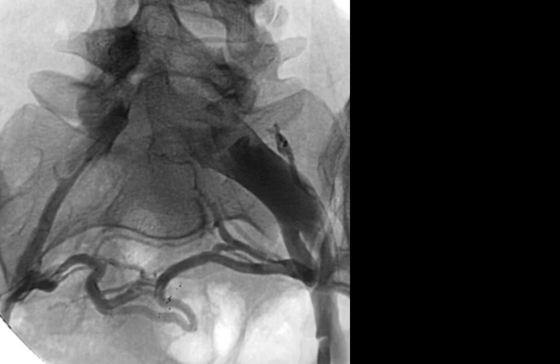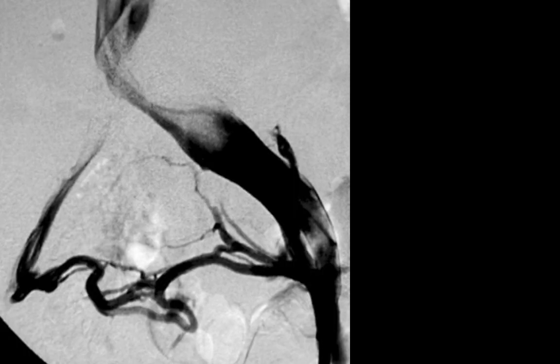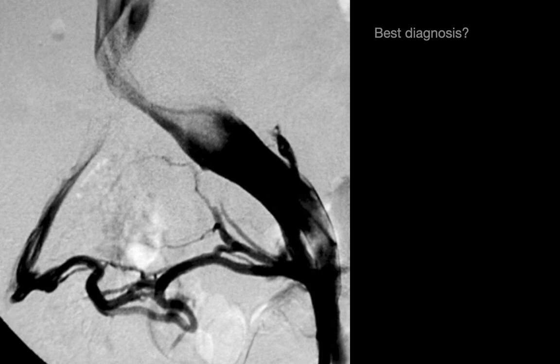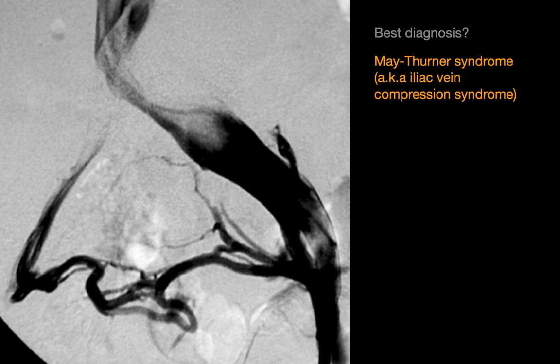These are interventional radiology board review cases, and this is group 2. The best diagnosis in this case is May-Thurner syndrome, also known as iliac vein compression syndrome.